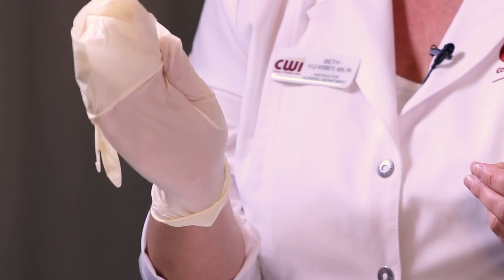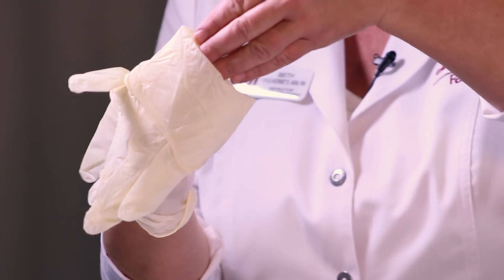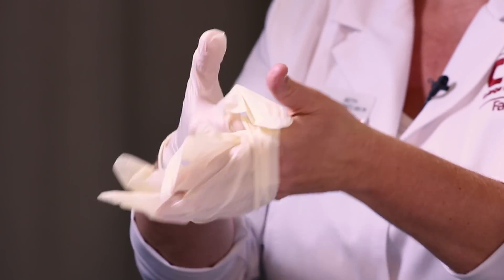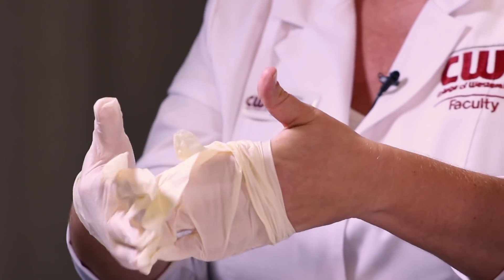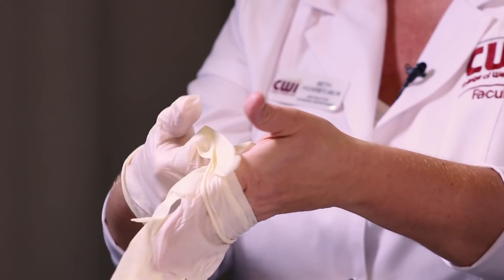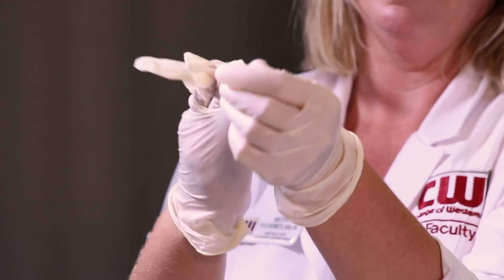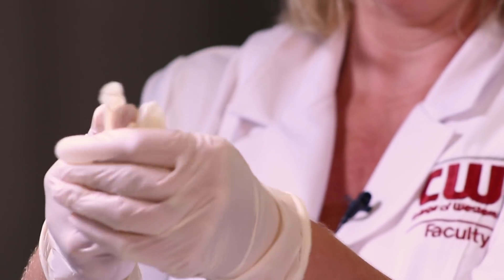Then put your four fingers under the cuff of the other glove, again with hitchhiker thumb. Now I'm sterile gloved, so I can fix the fact that I have two fingers in one.